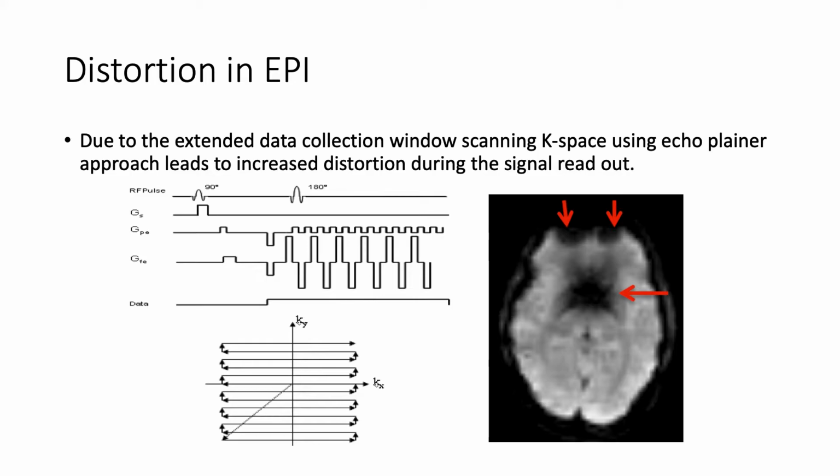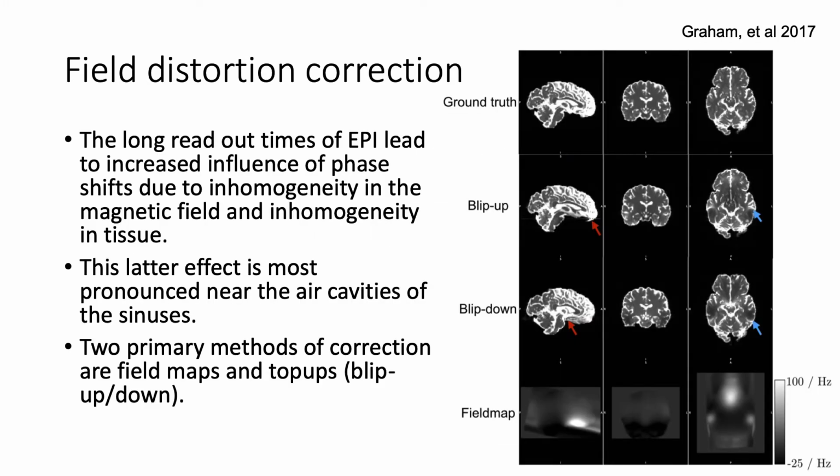So, to the question earlier, are there different tissues? Yes, that are influenced by some of these artifacts. And like I mentioned earlier, the cavities and sinuses are prone to these inhomogeneity problems. You can try to fix some of these using some methods that I will hopefully touch on a little bit.